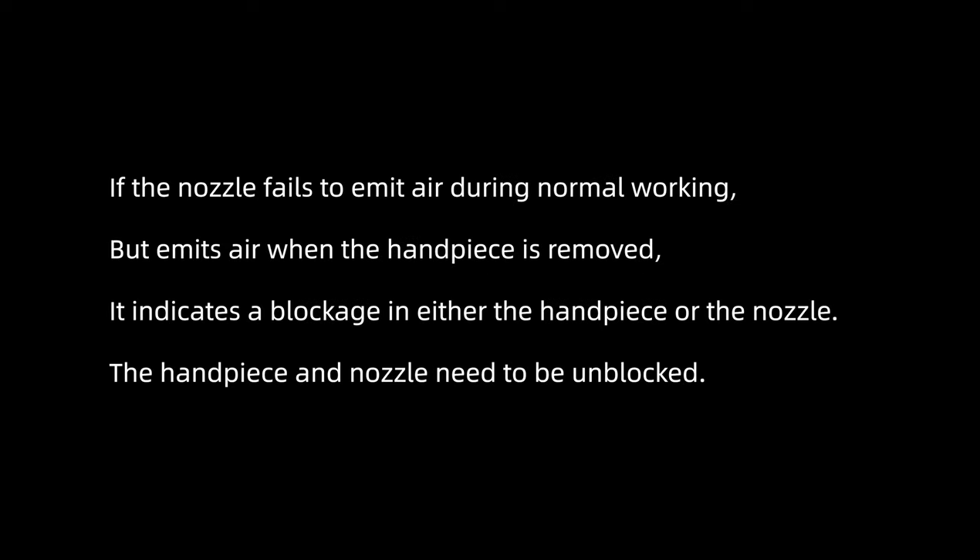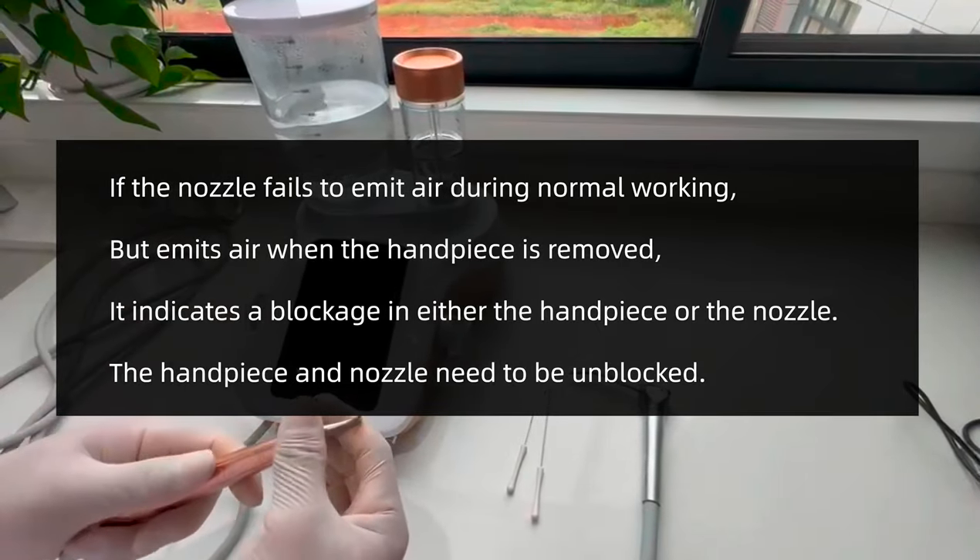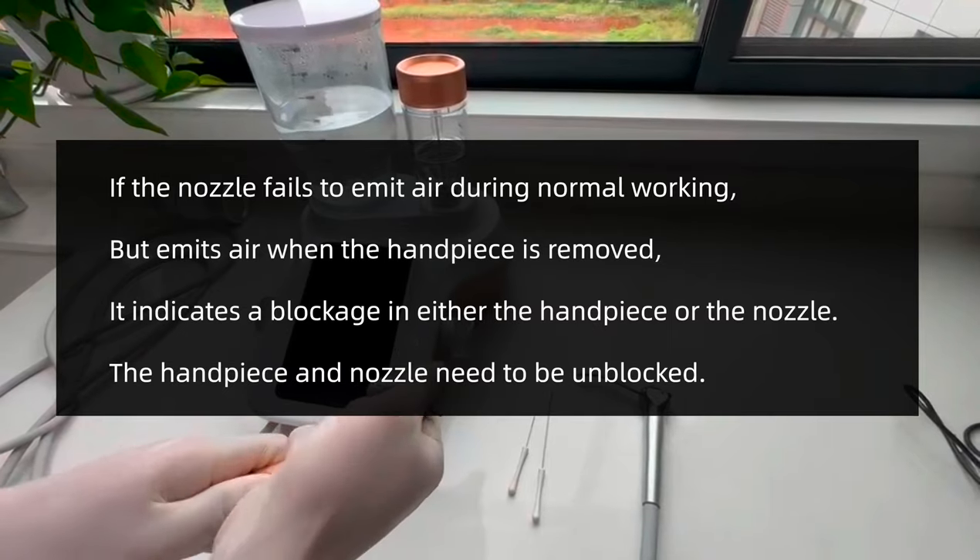If the nozzle fails to emit air during normal working but emits air when the handpiece is removed, it indicates a blockage in either the handpiece or the nozzle. The handpiece and the nozzle need to be unblocked.